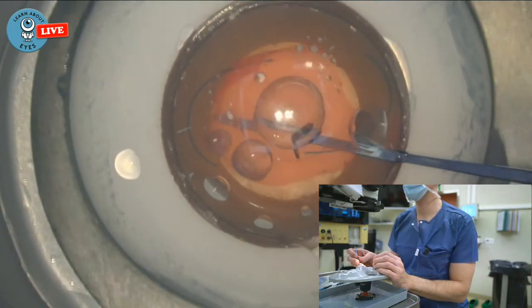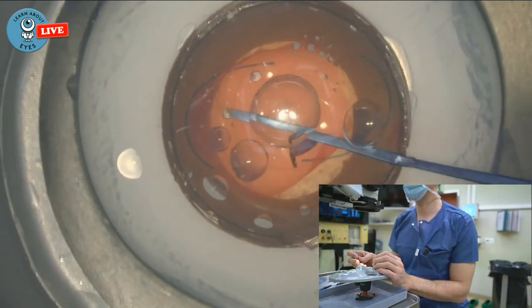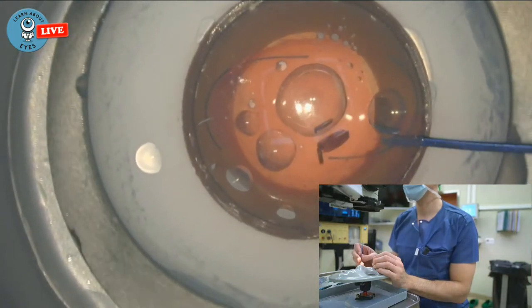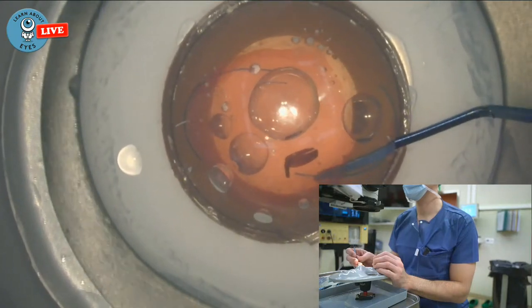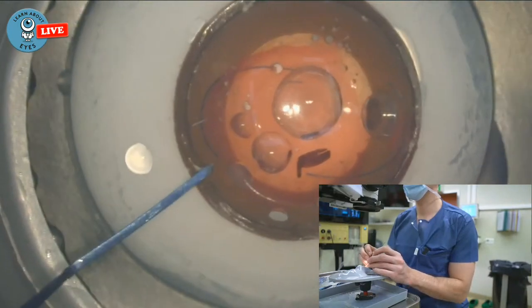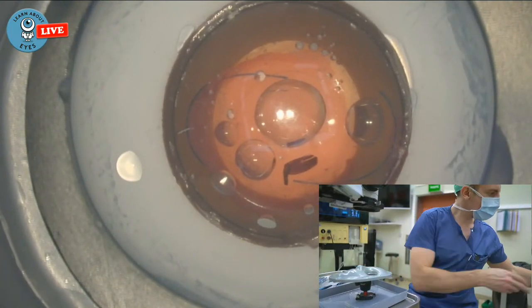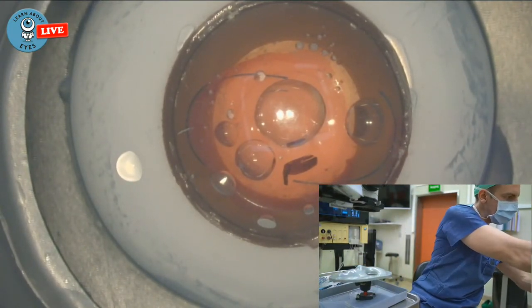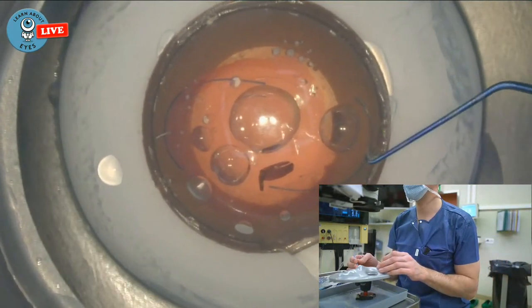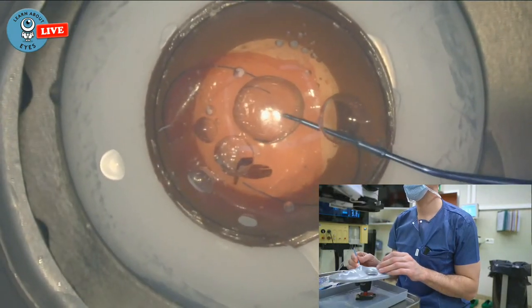Let's take this out. All the way out. There we go. Now, try and put this. Definitely not the perfect instrument for that. Let's see if this helps. Got a Sinskey hook. Probably a better choice. Much better.